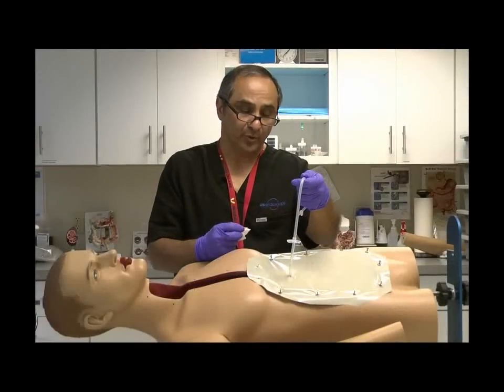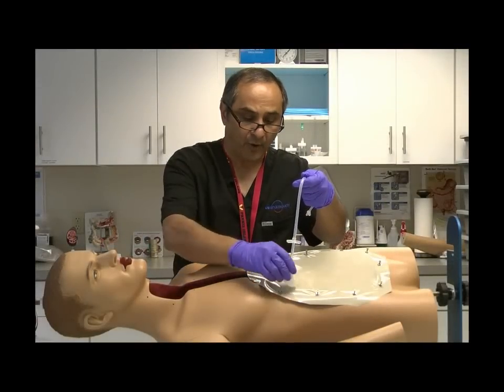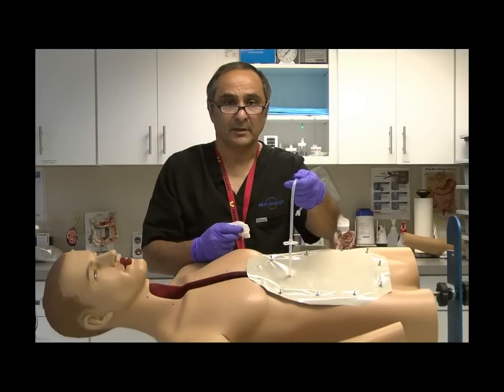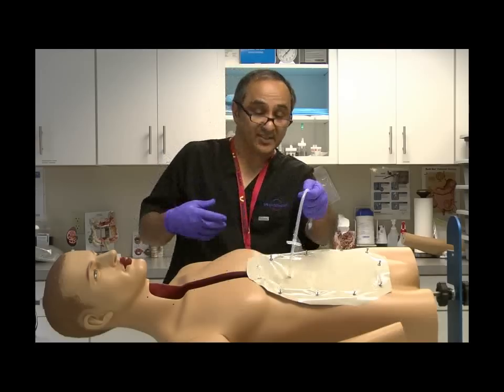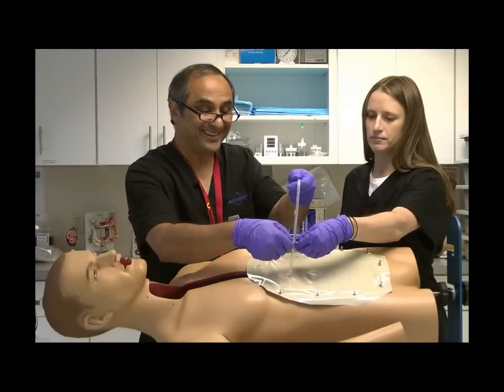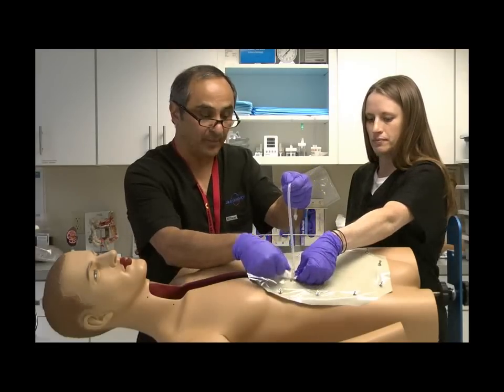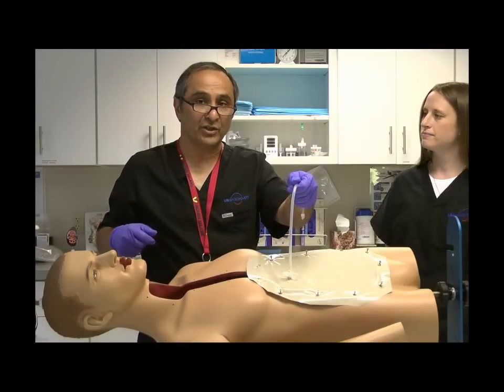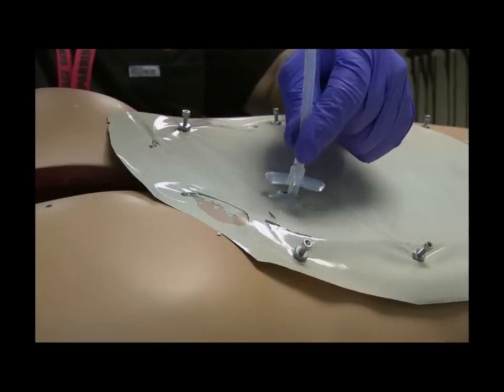Now that I'm comfortable knowing that the tube's in proper placement, I will go ahead and clean my peg site of any excessive lube, blood, or biomaterial. And then with the help of my assistant, we'll use the 2-handed technique for stretching and sliding the external bolster against the stomach skin. Remember, you can leave 1 to 2 centimeters of play between the external bolster and the skin.